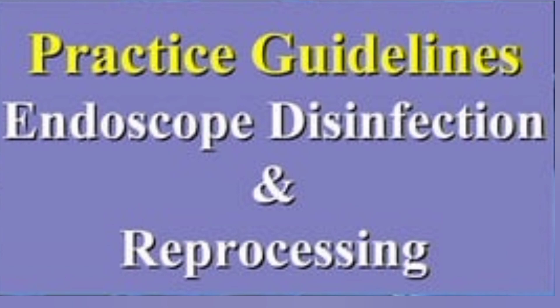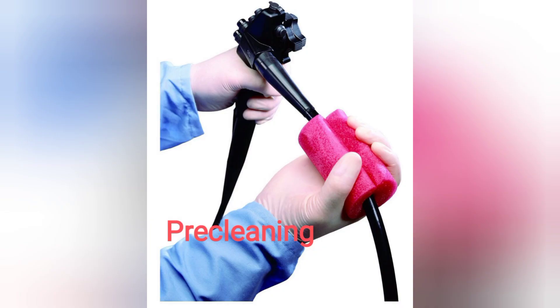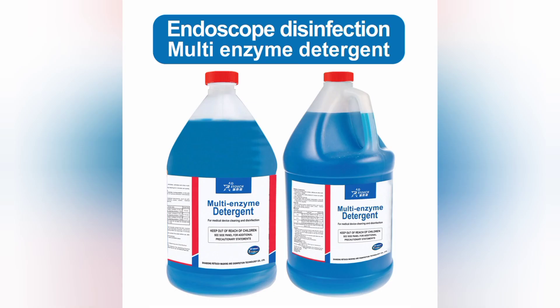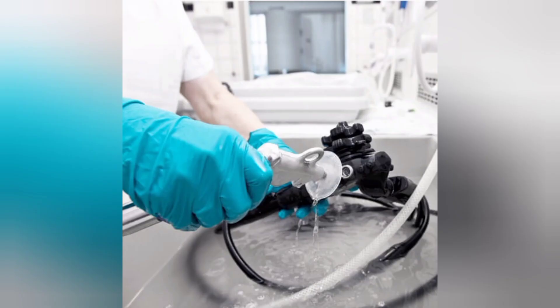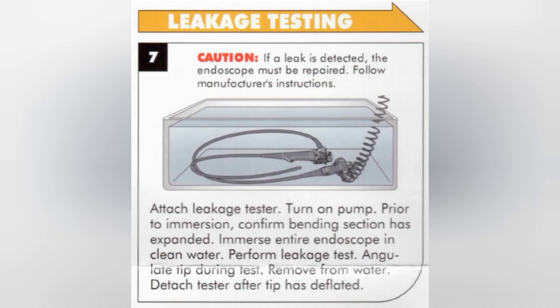The first step is pre-cleaning. Immediately after the procedure, wipe the endoscope with an approved enzymatic solution and flush out the channels with a solution to lubricate and loosen debris. After that, wash the air, suction, and water channels. Alternating air and cleaning solution will remove more debris from the internal lumen.